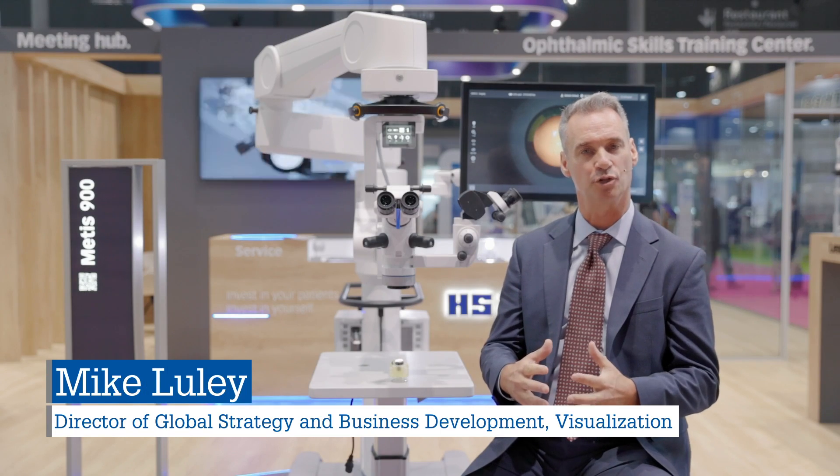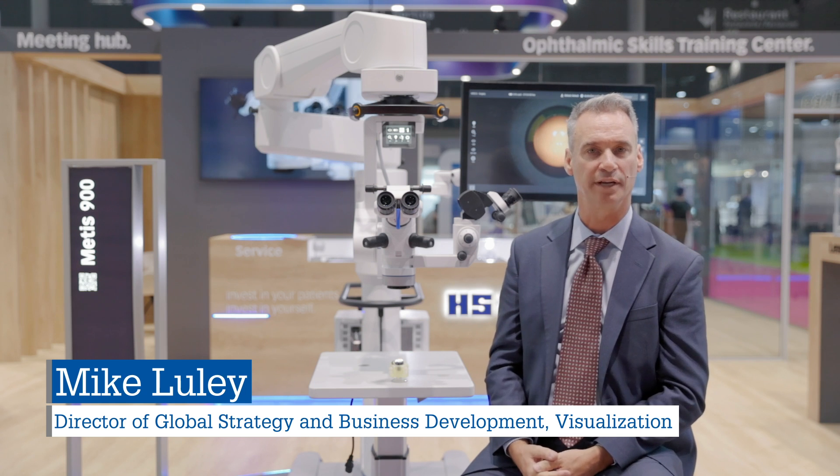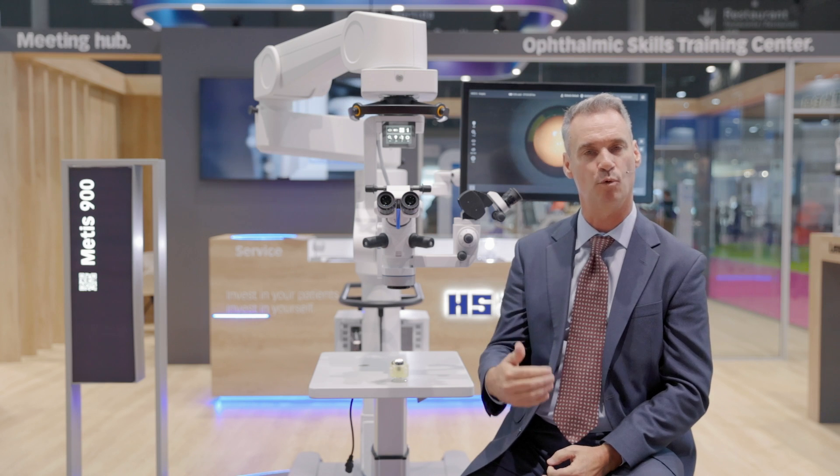The new Metis 900 microscope from Haag-Streit is a very innovative microscope. We've incorporated a lot of technologies that allow the surgeon to operate better, faster, and more effectively.